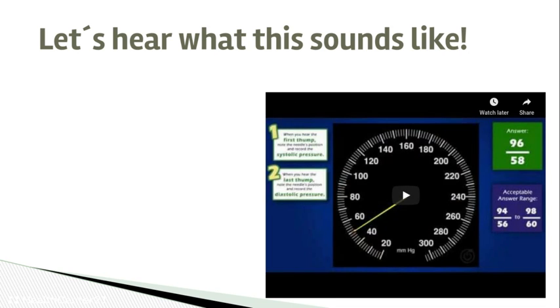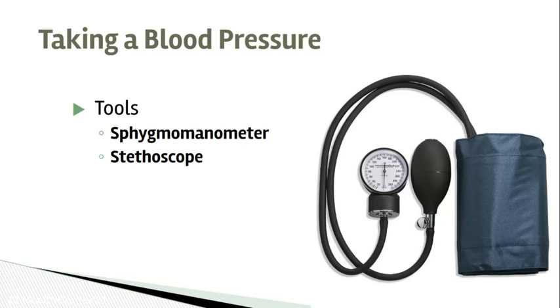So, did you answer all of them? Hopefully you were able to hear those Korotkoff sounds, which is really just the heartbeat that you're measuring, and hopefully you were pretty close. When you're learning how to take blood pressure, it can be tricky to hear that because sometimes, as you heard, it's pretty quiet, and then it gets a little more intense, and then it gets quiet again until you lose it.